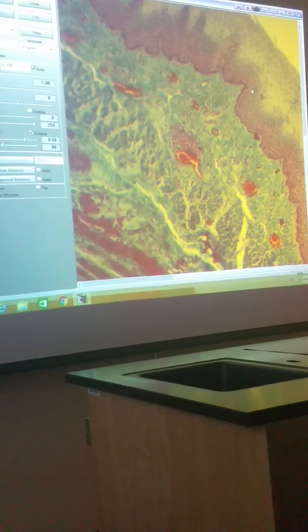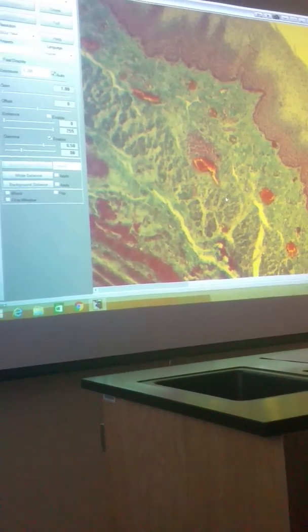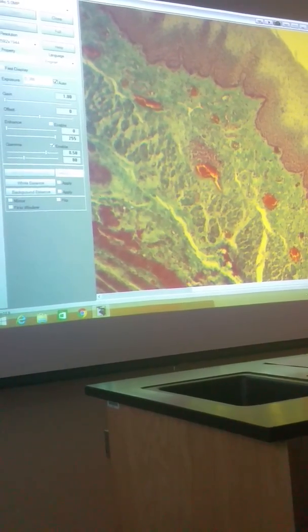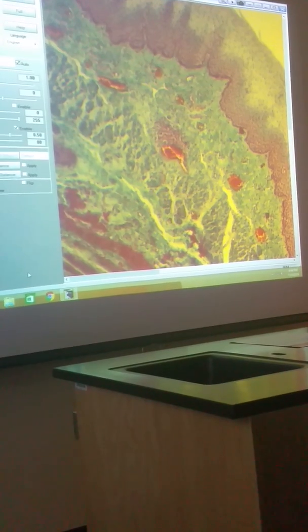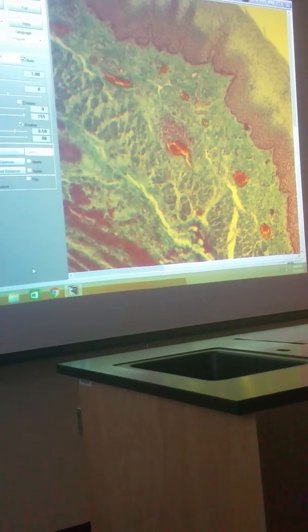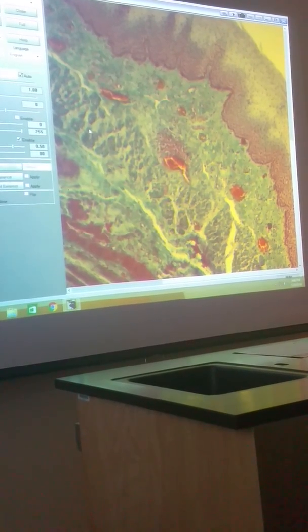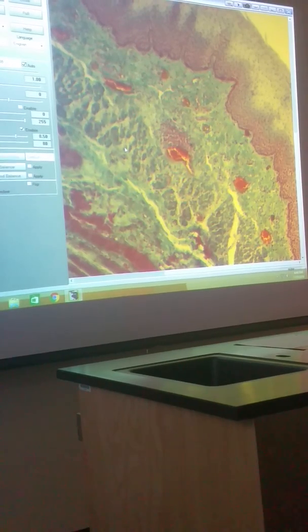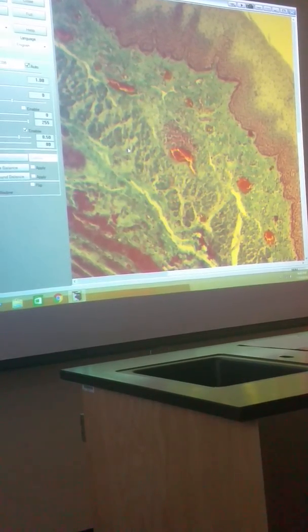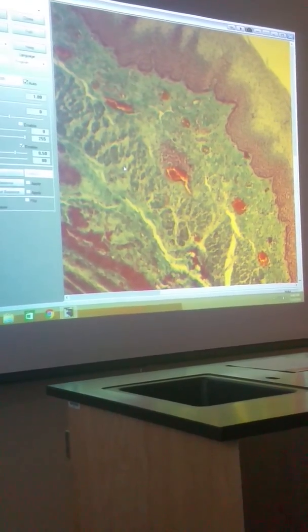And at the bottom is the adventitia, but you can't see the adventitia right now; you would see it if you go further beyond this. For muscularis mucosa, you'll ask what structure that is. Remember, the muscularis mucosa makes up the mucosa itself. The mucosa is made up of three layers: the stratified squamous epithelium, lamina propria, and the muscularis mucosa. Okay.